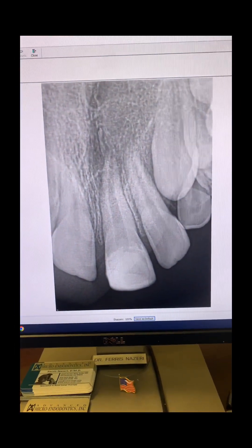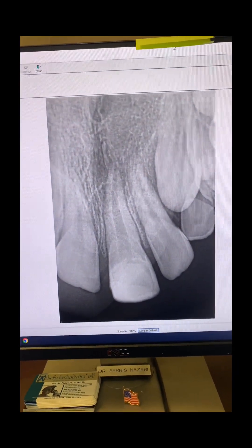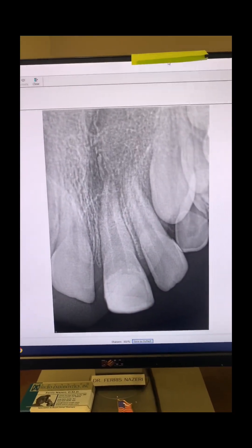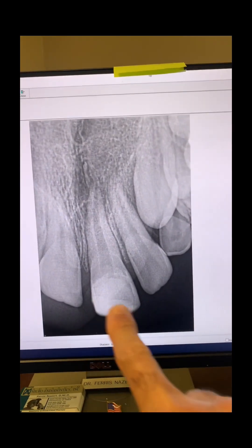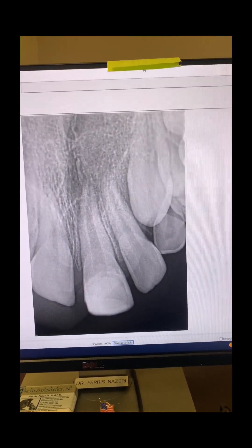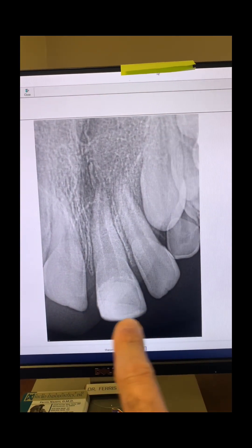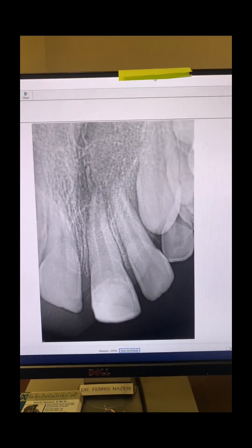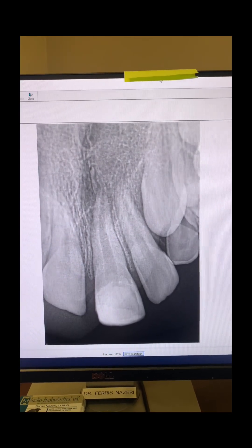This nine-year-old patient was referred to me for endodontic treatment of tooth number nine. When she was seven years old, she was playing and hit tooth number nine against a piece of furniture and cracked the tooth. She was taken to her dentist at the time, two years ago after the accident, and the dentist rebuilt the fractured part of the tooth with a tooth-colored filling and told the parents the tooth seemed to be okay and no further treatment was needed.